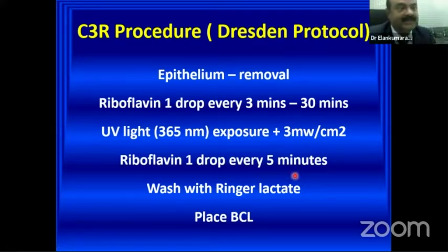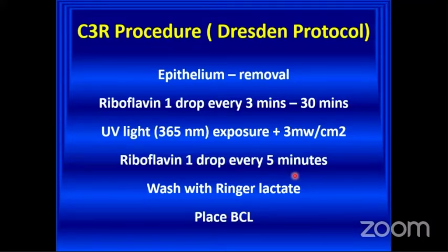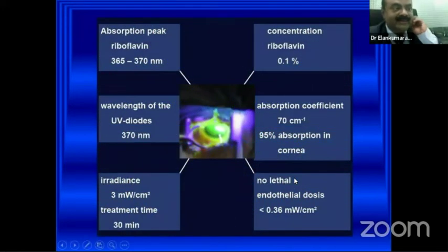There were various variants that came out of this. Transepithelial, that is without removing the epithelium, went out of use very fast, and something called accelerated cross-linking. But before going to that, let's see what the riboflavin and the procedure does.